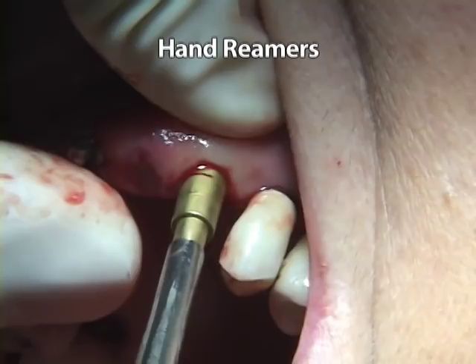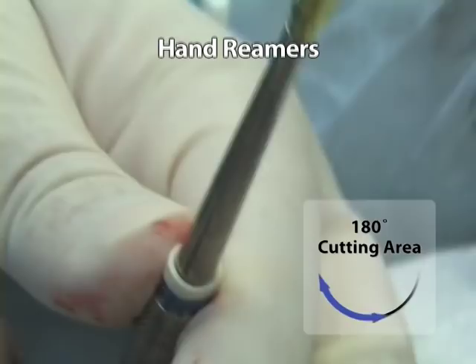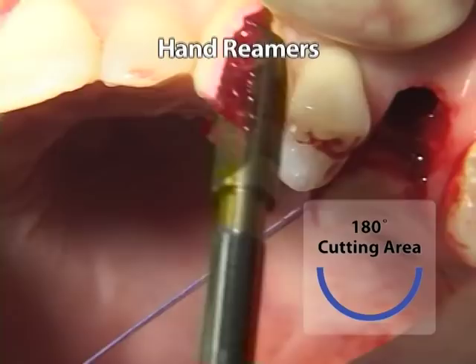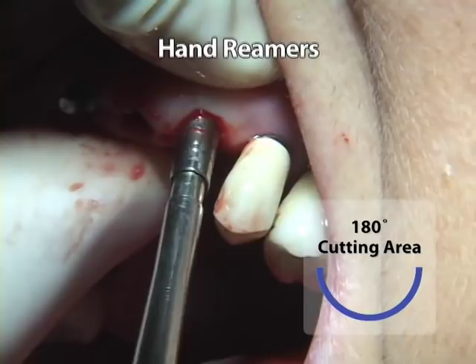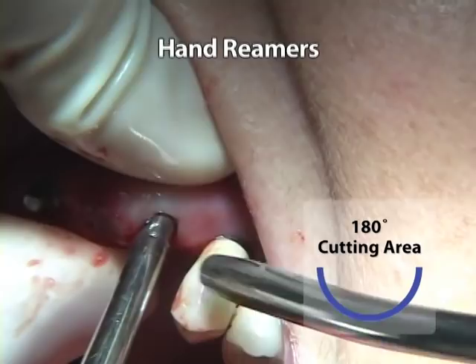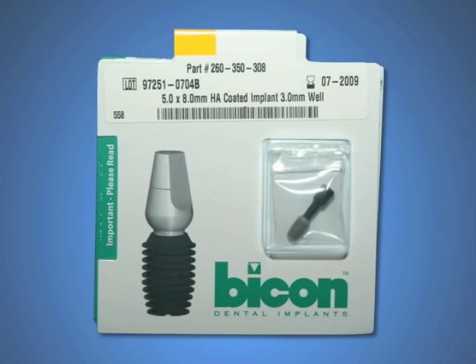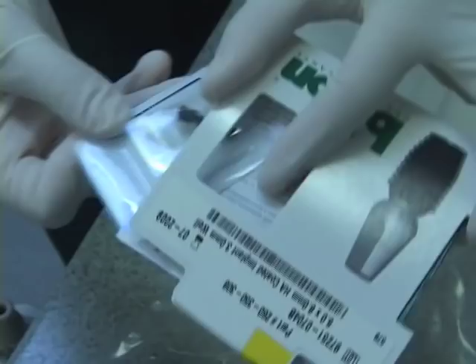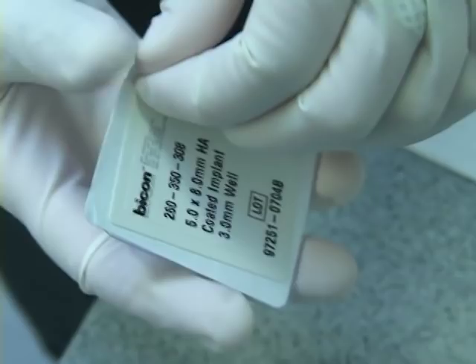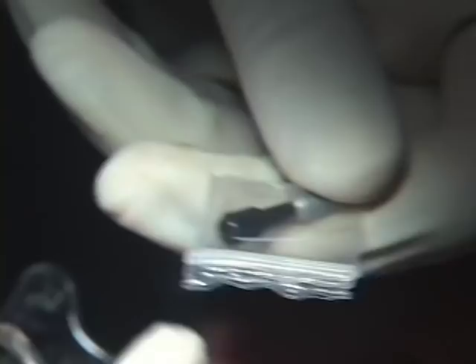The use of hand reamers facilitates a clinician's perception of the harder cortical layers of bone around the osteotomy, as well as the movement of the thin walls of an osteotomy. Therefore, the use of hand reamers enhances the clinician's ability to avoid inadvertently penetrating the nasal floor, the maxillary sinus, or the walls of an osteotomy. A hand reamer's single cutting surface allows for only cutting the palatal side of an osteotomy while expanding the buccal ridge side as it is rotated for only 180 degrees with cutting pressure rather than a full 360 degrees. The sterile blister package containing the selected implant is removed from its cardboard folder by the circulating assistant, who tears open the Tyvek backing and carefully drops the sterile inner plastic bag containing the implant and the plastic healing plug inserter onto the sterile instrument tray.